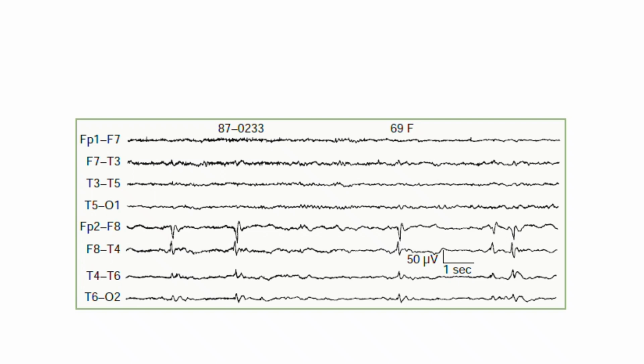The anatomical localization perfectly mirrors the patient's clinical history. The structural cause: the patient suffered a stroke in the territory of the right middle cerebral artery, MCA. The MCA supplies the lateral surface of the cerebral hemispheres, including the temporal lobe. The ischemic insult left behind a localized scar, gliosis.